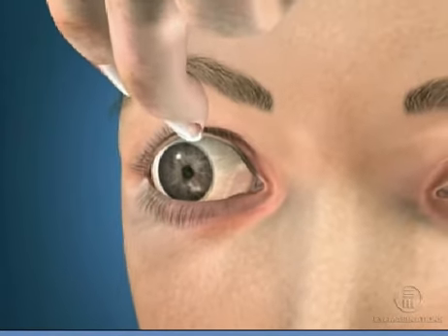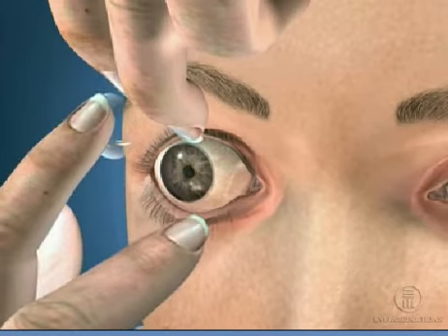Step 2 is to pull down your lower eyelid by its lid margin using the middle finger of your inserting hand.